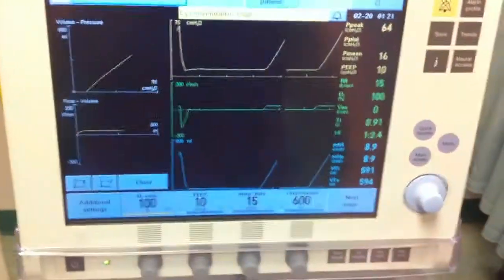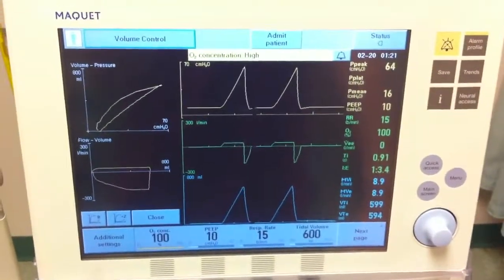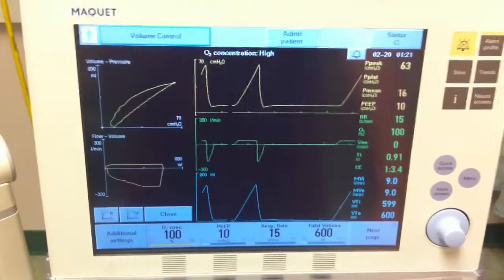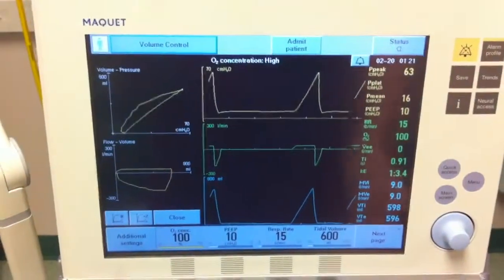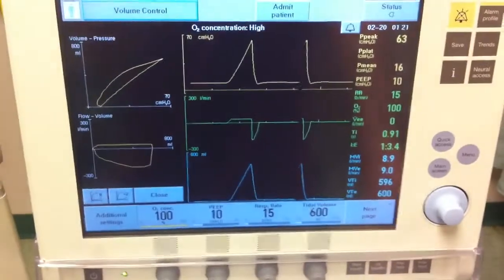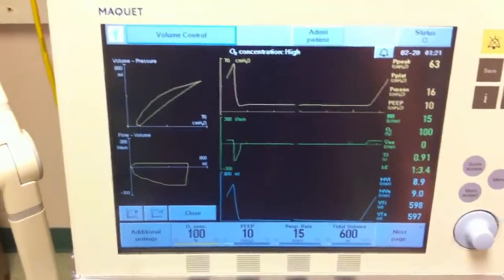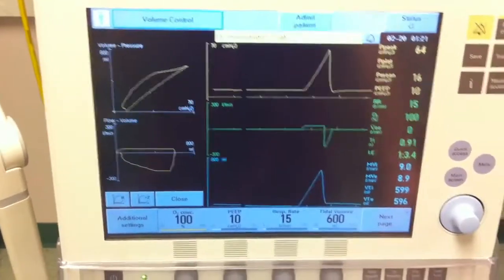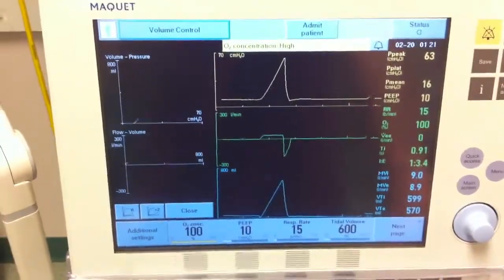However, during the patient's stay in the ICU, it was noticed that her arterial blood gases indicated refractory hypoxemia in spite of FiO2 being increased, in spite of high levels of PEEP. You currently find the patient supine in the ICU bed at the sending facility. They are requesting that you transport the patient to a larger level 1 trauma facility for care and pulmonology services unavailable at the sending facility.